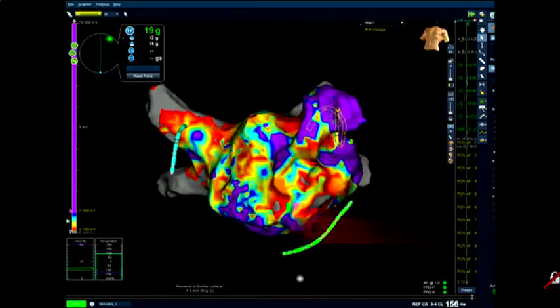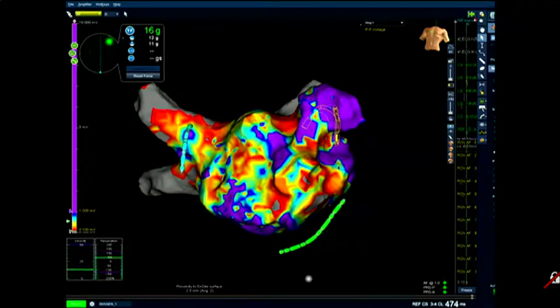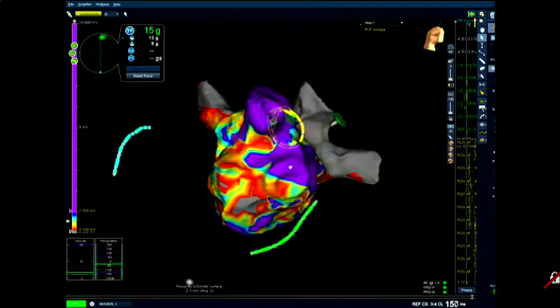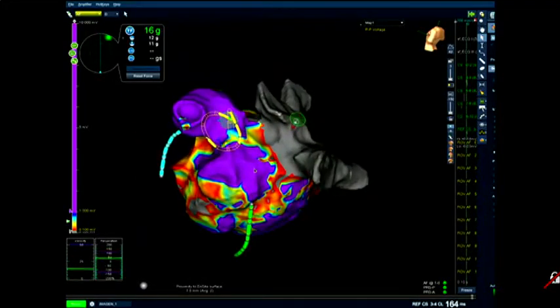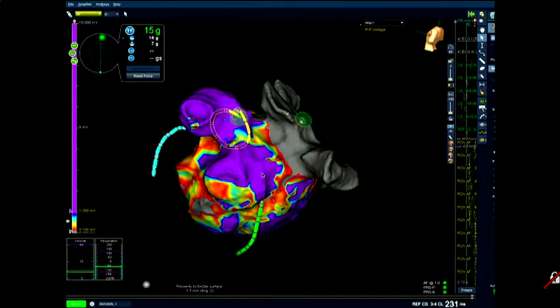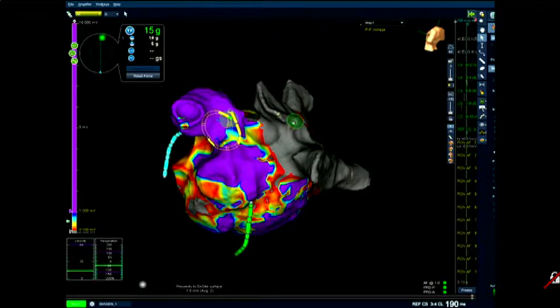In the appendage there was an atrial tachycardia, which they ablated the os of the left atrium, and you can see the remnant of the ablation line that they tried to do for the mitral flutter in the latest procedure. After doing this, then please give me the image number 1.